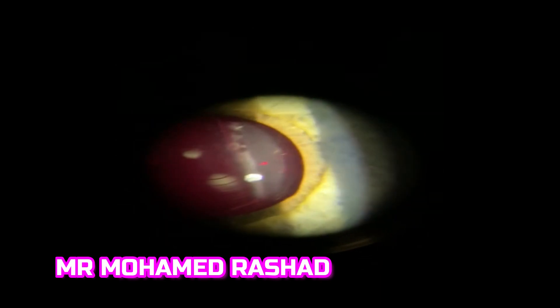Then the other side from the center to the periphery. Always make sure you are focused on the capsule.